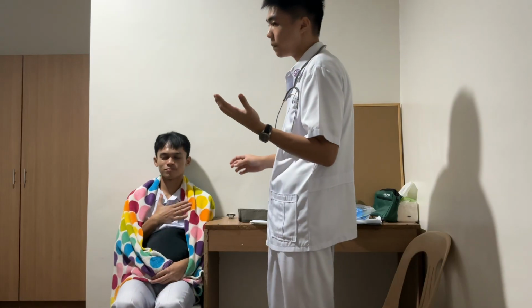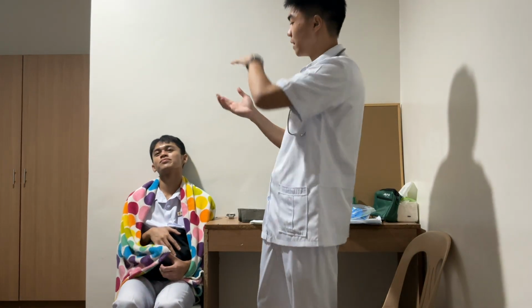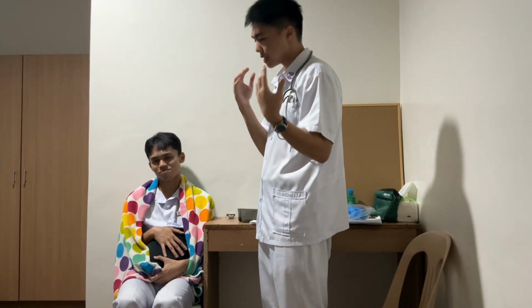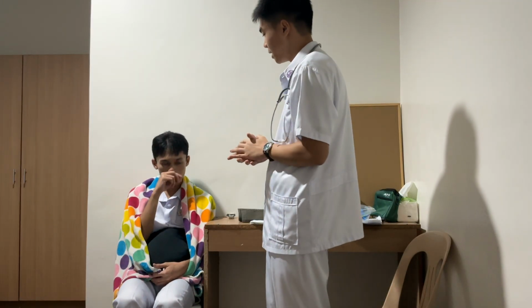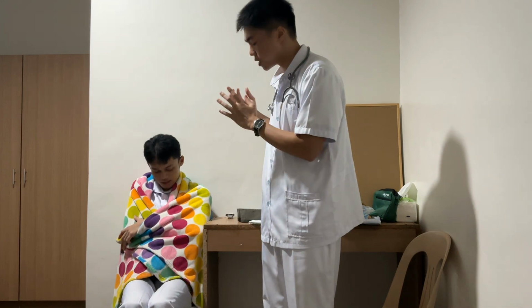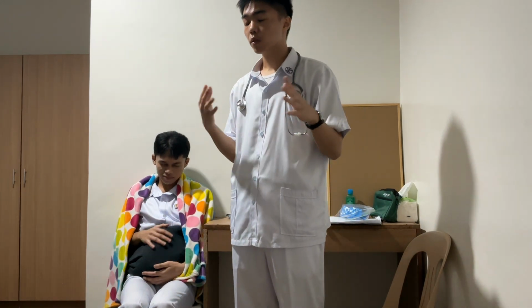The normal blood pressure for systolic, or the number above, should be 100 to 120, and below, the normal should be 60 to 80. And yours was 70. Yes. Okay, so that is everything on blood pressure. If this is the patient's first time to take the blood pressure, then we can wait 1 to 2 minutes to let it rest, and then we can get accurate results.